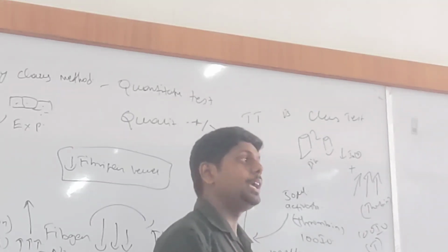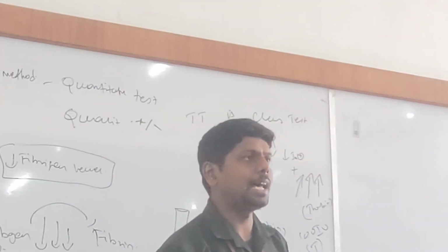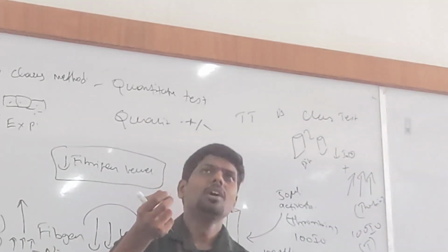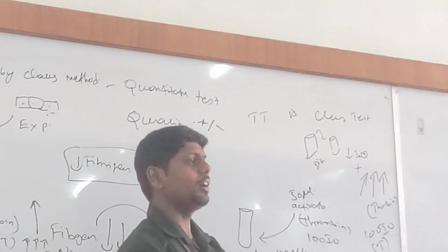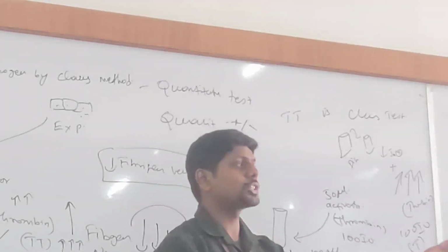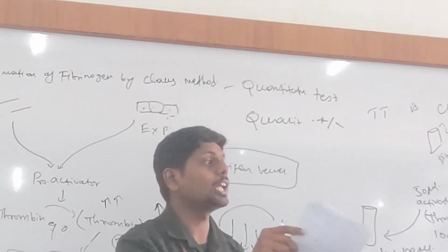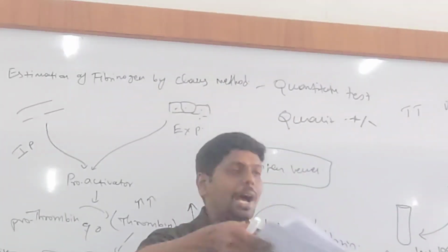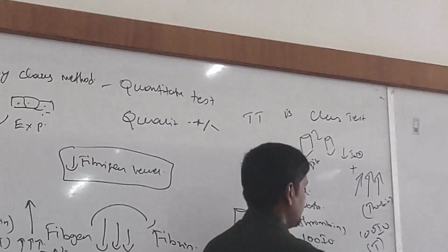This will give false positive results in case of leukemia, if the patient has some cancer or lipidemia. Fibrinogen looks very similar to lipids. If the patient has excessive cholesterol, this test will come as an elevated TT. Got my point? If the patient has more cholesterol that blocked the heart, but we suspected it is a DIC condition. Even cholesterol will cause pulmonary heart disease. Do you remember? Cholesterol will block the blood flow actually. So yeah, we need to cross-verify with differential tests.